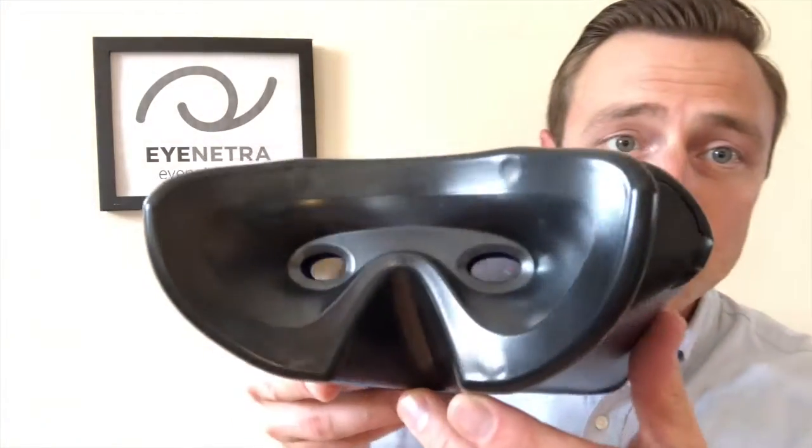In order to keep your iNetra autorefractor clean, we recommend using a gentle alcohol swab around the perimeter of the face shield to help remove any surface oils or makeup which may build up on the device. To clean the lenses or apertures themselves, if there's any dust or particulate matter that happens to get in there, a gentle lens cloth to buff them out will do just fine.